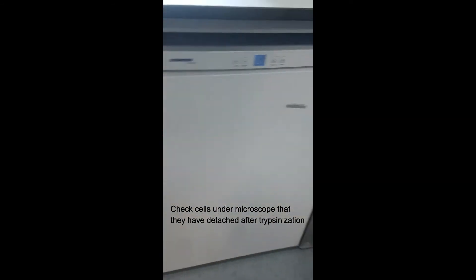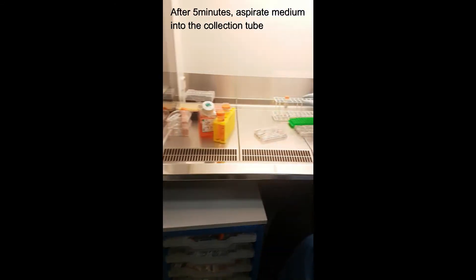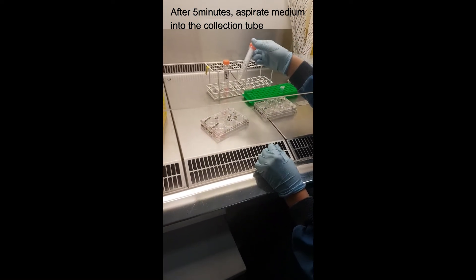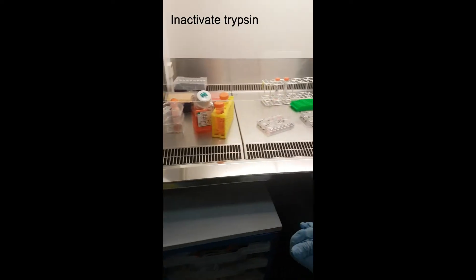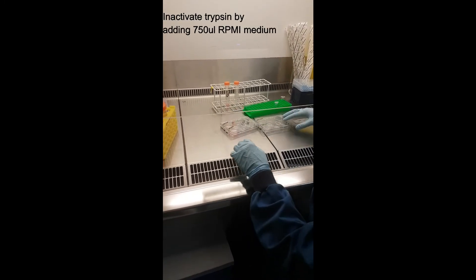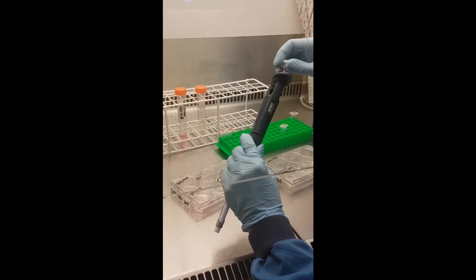We're back after the trypsin incubation. Aspirate the medium off — if we're also using cells for ELISA, we have a collection tube for that. Because the timer is down, the first thing you should do is make sure you activate — or rather stop — trypsin by adding medium to the cells. Do the collection and other steps afterward, but adding medium first is really important.